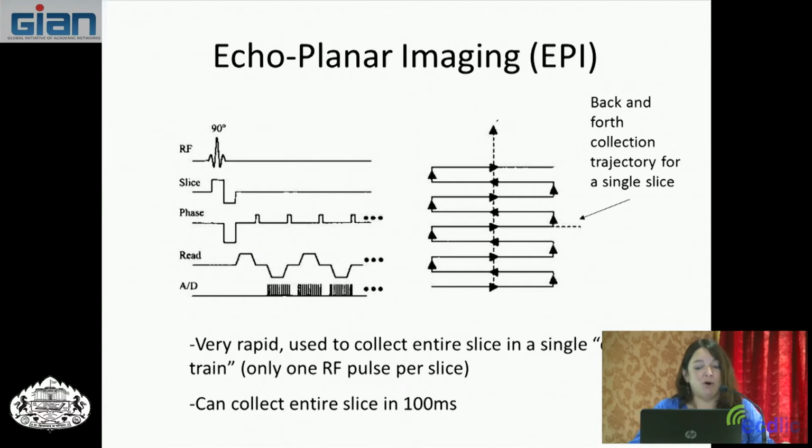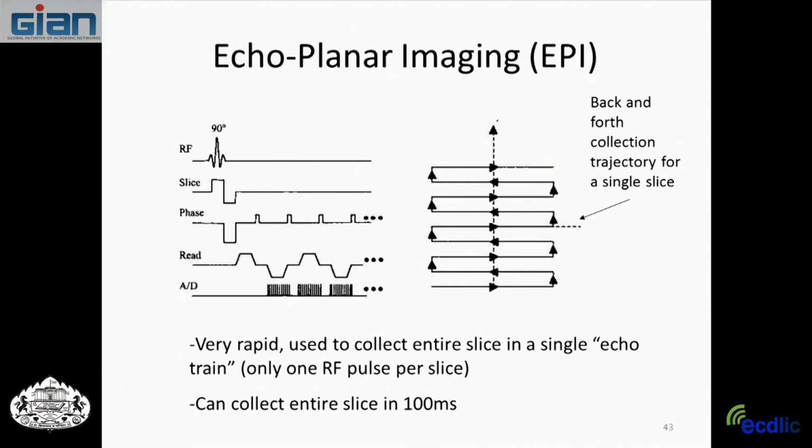Okay, we talked about pulse sequences, and we talked about spin echo. So we're not going to go over that again today, but that's that technique where you flip and then you flip 180 degrees to get the phase coherence to converge again rather than diverge, and you can get rid of the T2 star effects using this and get an optimal image.